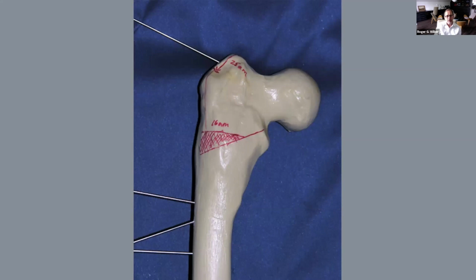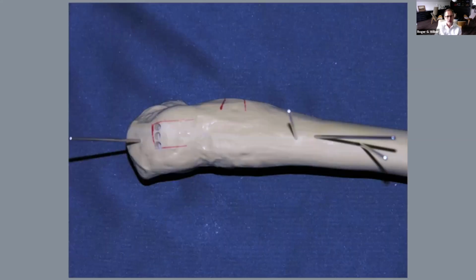Again, intraoperatively, you can make marks 25 millimeters down for the start of your blade plate chisel, and 16 millimeters on the lateral cortex. You can make little marks as to where you believe your osteotomy is going to be. I like to use a small, very sharp chisel to make these marks, because usually a bovie tends to wear off as you're working in there. So a small score line using a sharp osteotome is very valuable.